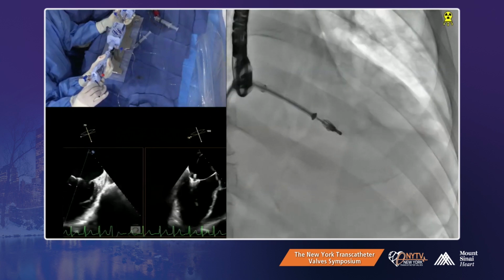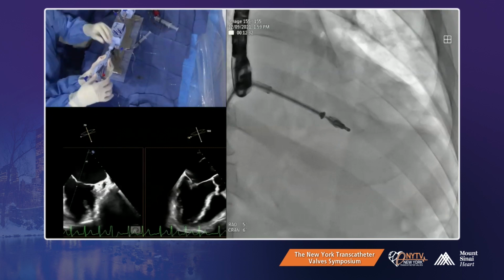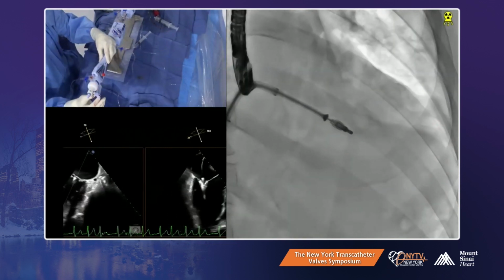Very dynamic. Okay, close. 60. Lock, lock. No, lock. Oh, we lost again. No, you don't have it. We lost it again. Let's see. Yeah, you need to lay the clip down.